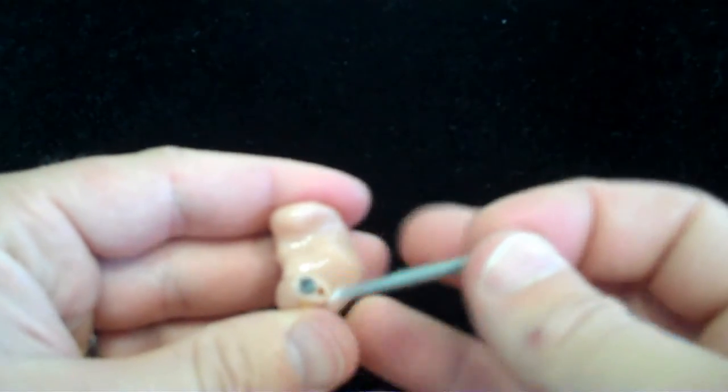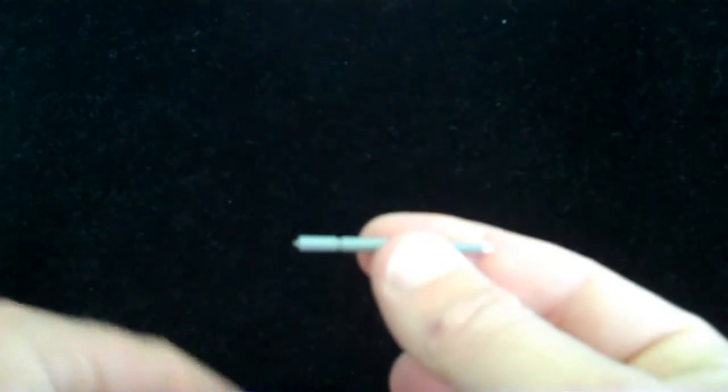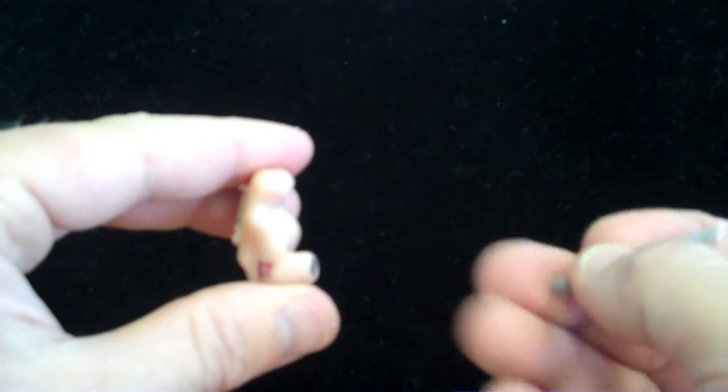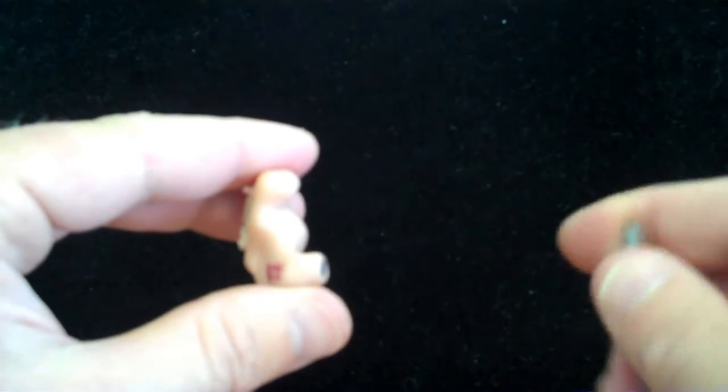There you go. Now this particular one is not the correct wax basket, but I'm showing you for demonstration purposes. If it was, we would take the same tool here, poke, pull to remove the old filter, turn it around, push, and leave the new filter in the custom in-the-ear device as well.